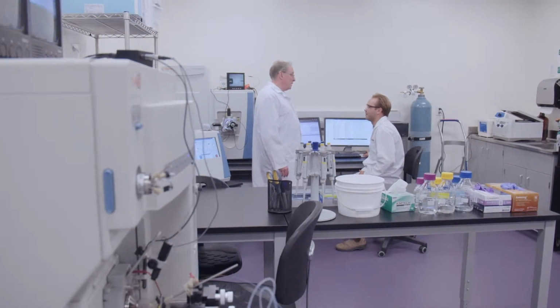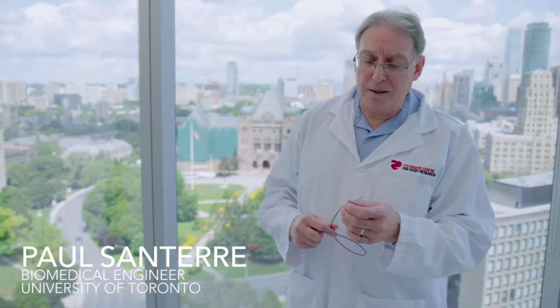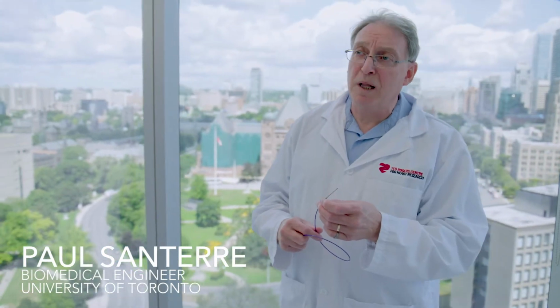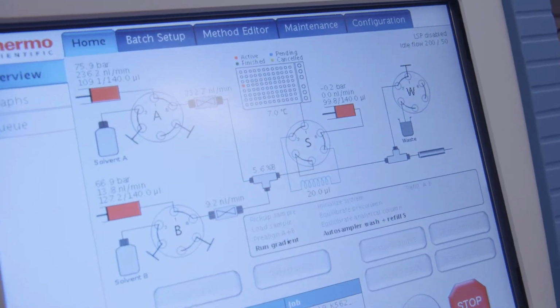So what I've got in my hands here is what we call a catheter product. Catheters are little plastic tubes that we run through lots of different pathways in the body, but quite often through blood. One of the very first technologies that we developed actually changes the chemistry on the surface of the material, and by presenting that diverse chemistry, we can fool proteins interacting with this plastic into thinking that they're still swimming around in blood.